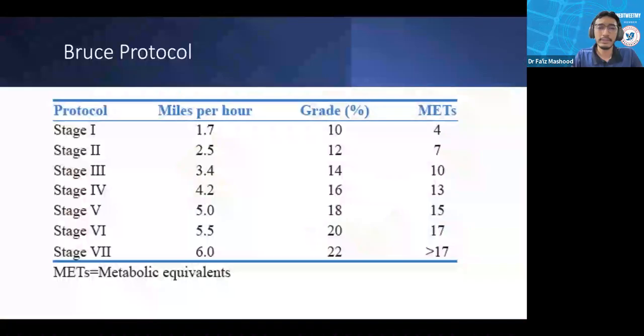For EST, we use the Bruce protocol. In certain events, we use a modified Bruce protocol for post-cardiac revascularization patients. So what is the Bruce protocol?